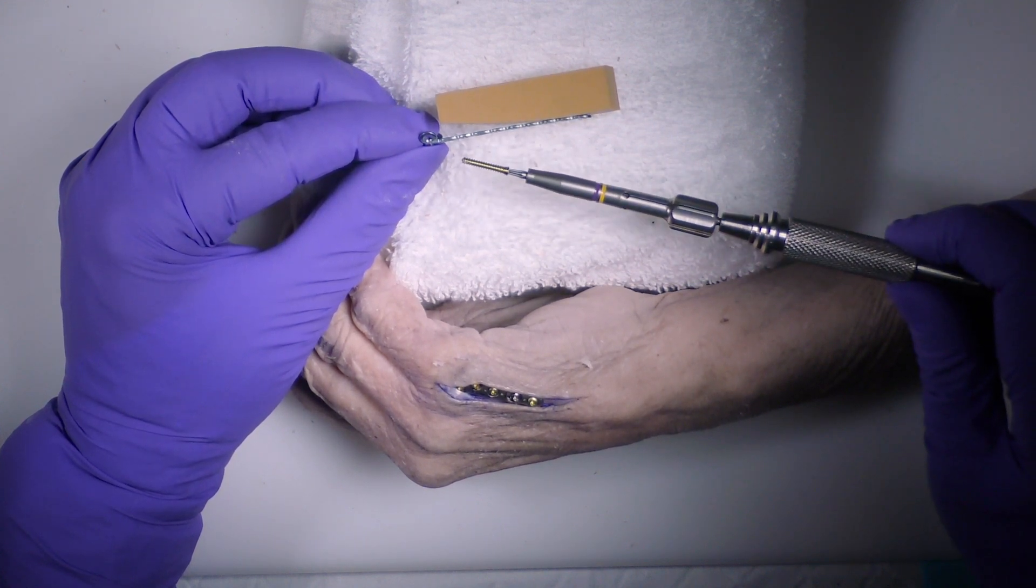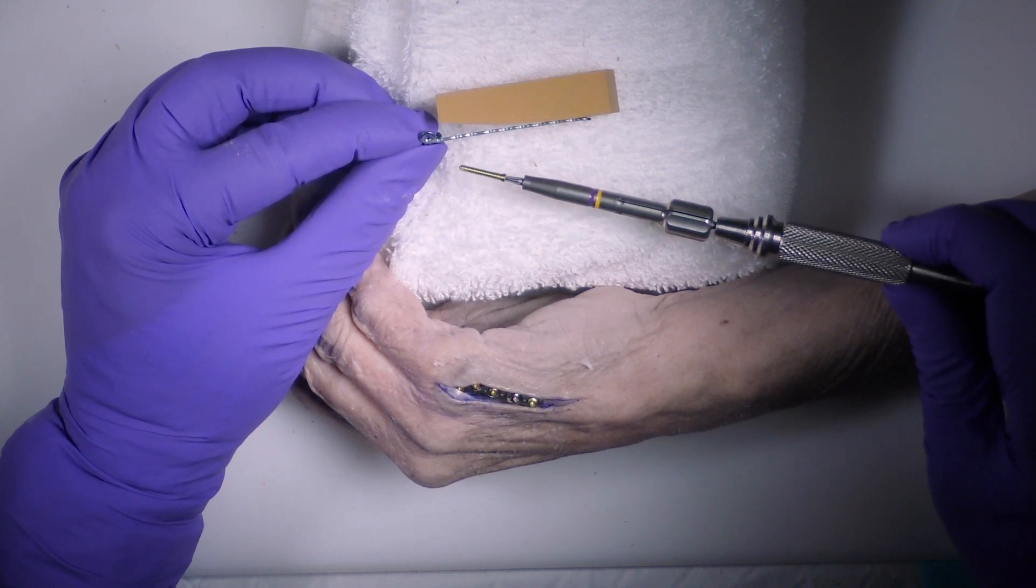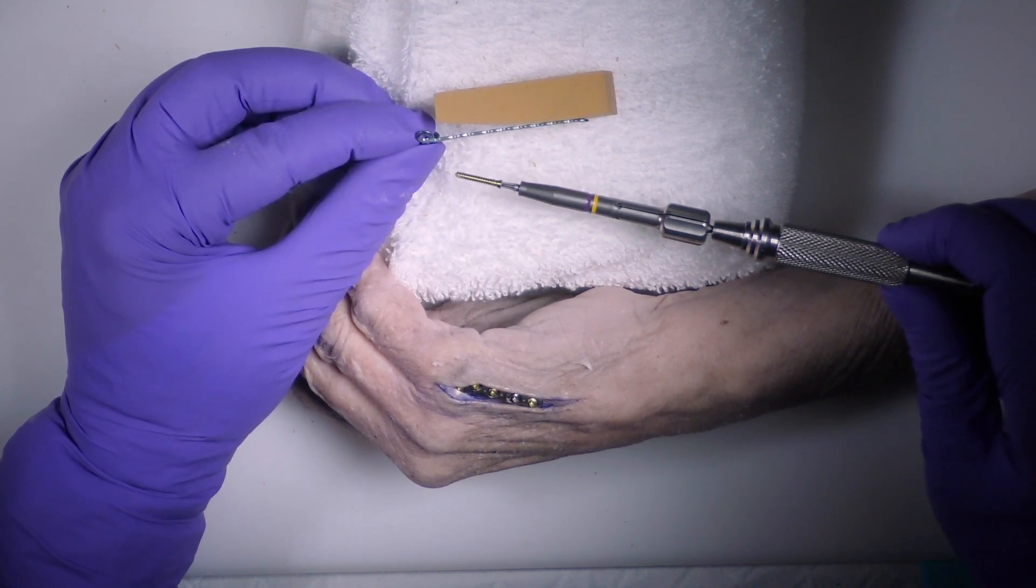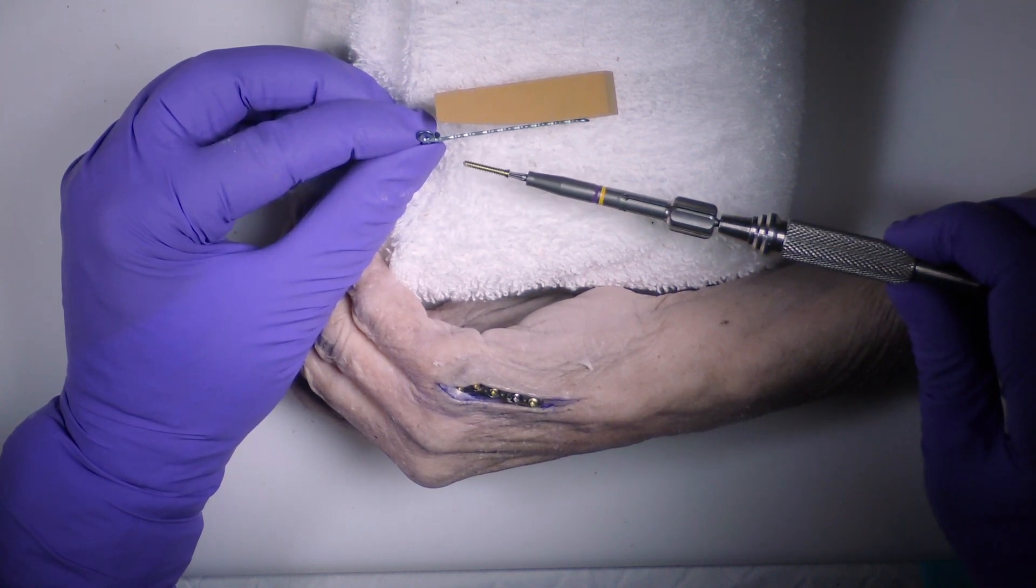Typically in that situation, what we'll do is use a non-locking screw, either definitively or provisionally, to reduce the plate and the bone together.